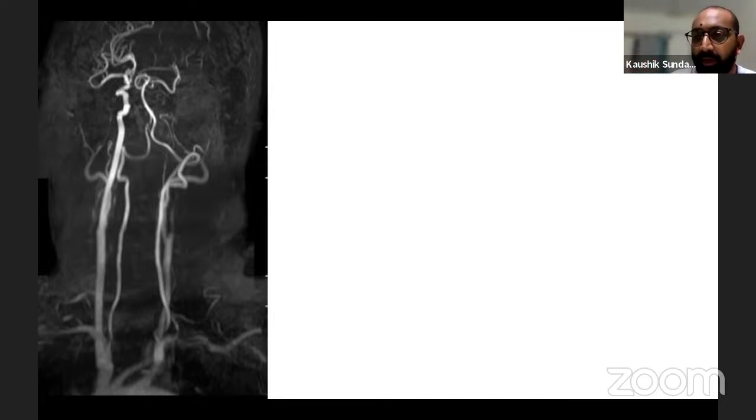Am I dealing with an acute carotid artery occlusion, probably due to a distal embolic source that went from the heart, and then it occluded the T, and I'm not able to see the proximal carotid? Or am I dealing with a chronic carotid artery lesion? Then the next question I need to ask myself, if it is a chronic carotid artery lesion, is whether this is a chronic carotid occlusion or a chronic carotid stenosis.